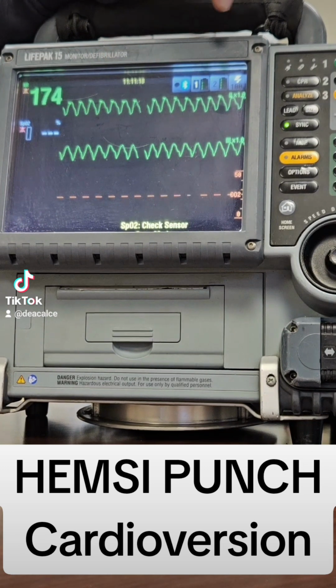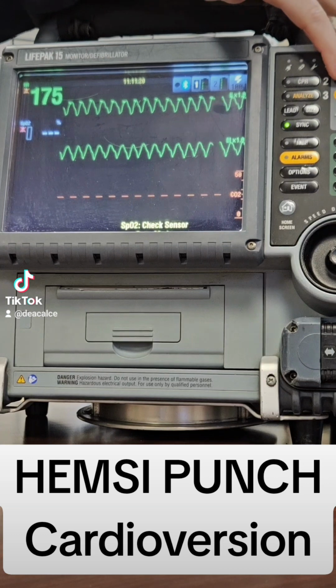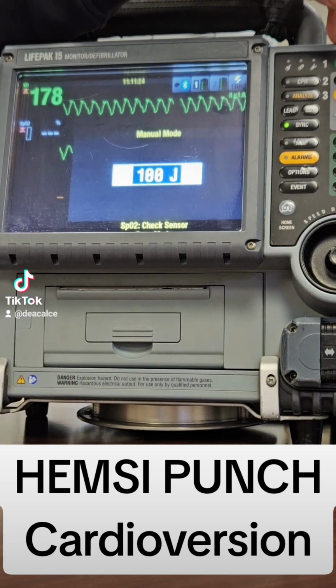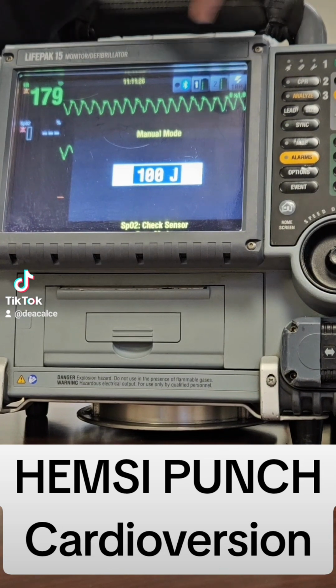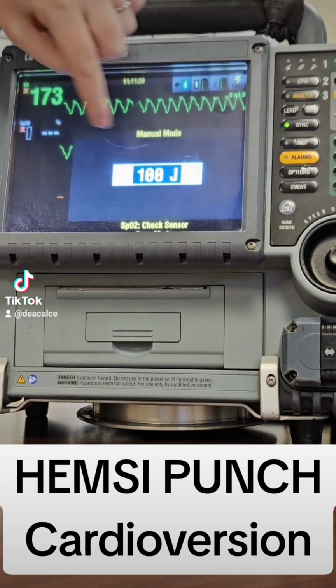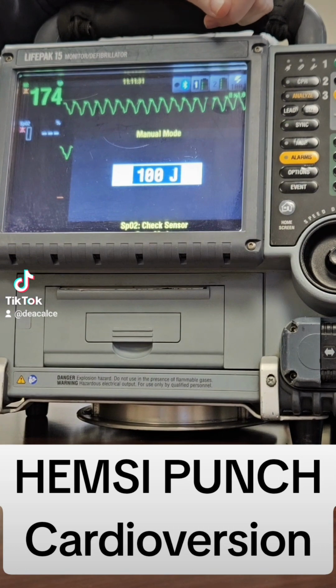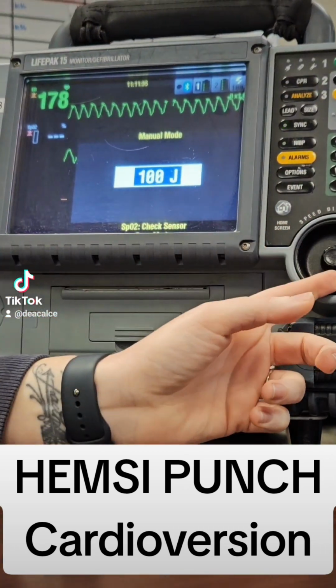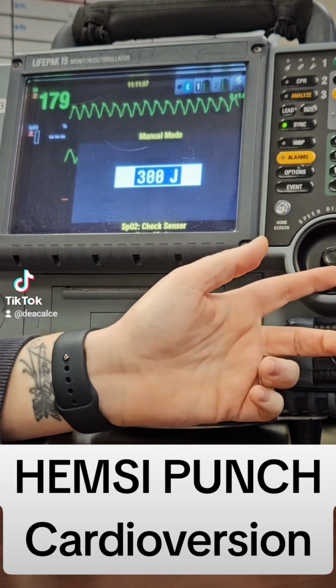Alright, it's important to know that once we sync it, we do have to select our energy. So for our SVT patients, we'll start at 100 joules. For anything else, we will go at 360. This is indicating VTAC. Typically, your monitor will start at 360, but as of right now, it's starting at 100 because we've been using this one. So we need to go to 360.